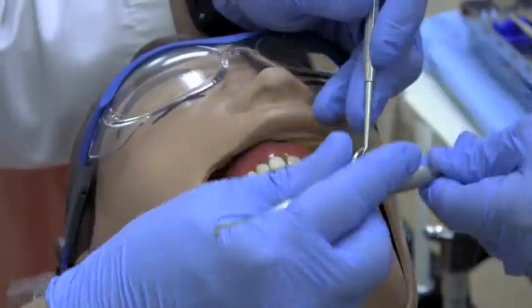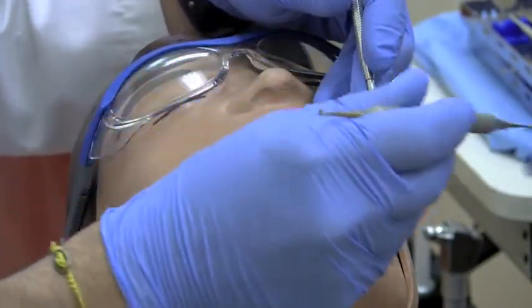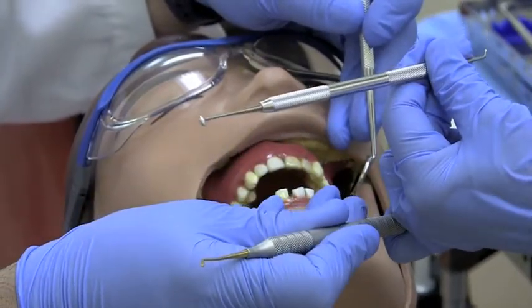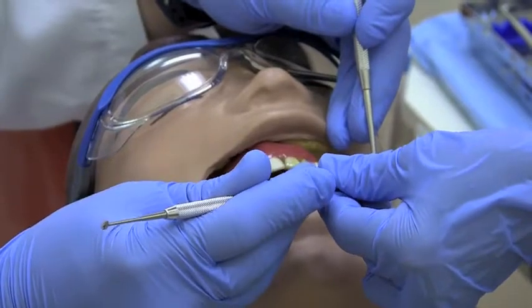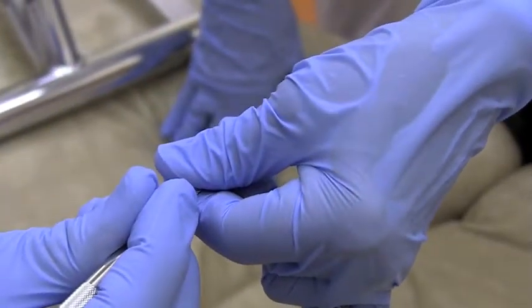When transferring an instrument, it is important to securely place it in the operator's hand. When switching instruments, have the new instrument grasped between the thumb and index finger. Use your baby finger to securely hook the instrument that is no longer needed, then pass the new instrument to the operator.